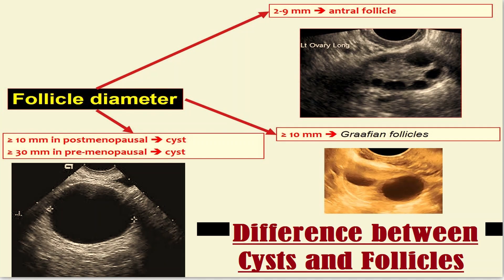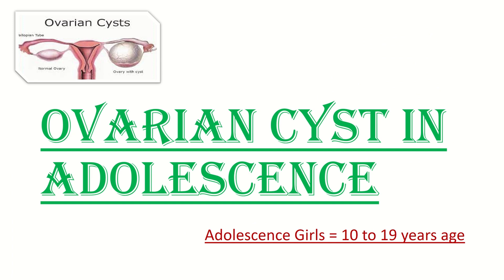Here you can see the difference between a cyst and follicles. In postmenopausal women, any structure of 10 mm or more is referred to as a cyst. In premenopausal women, 30 mm or more is classified as a cyst. If the size of a simple mass is 2 to 9 mm, it is more likely an antral follicle, and if it is more than 10 mm, it is a Graafian follicle.